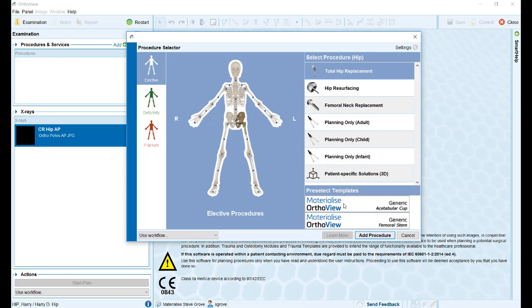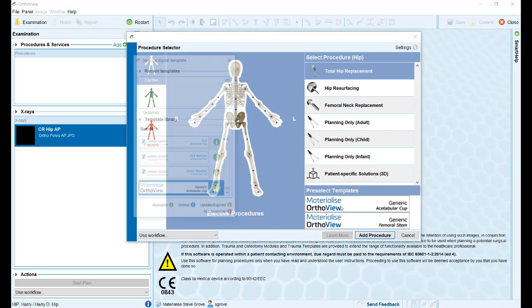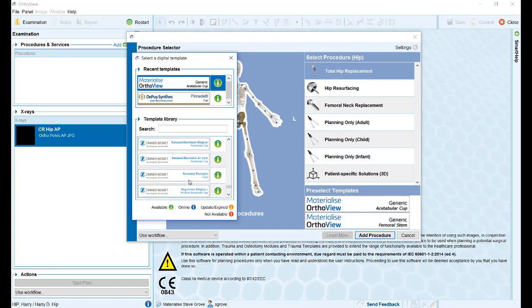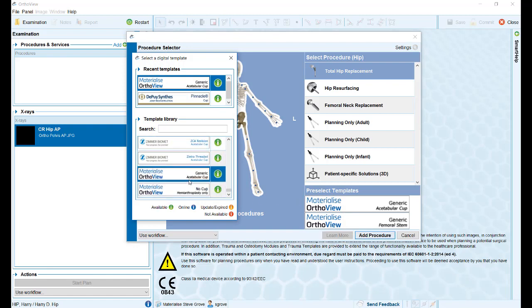Users now have the option of pre-selecting their implants for their chosen procedure before starting their plan.